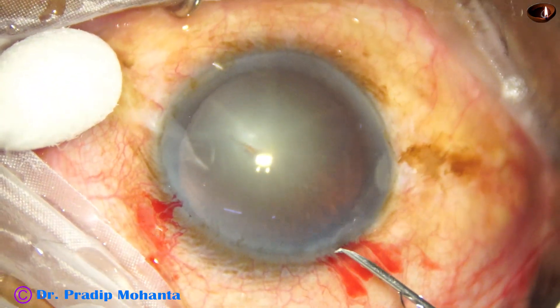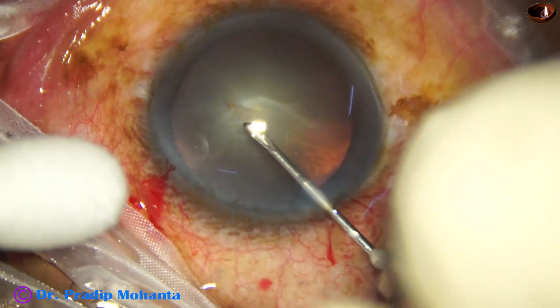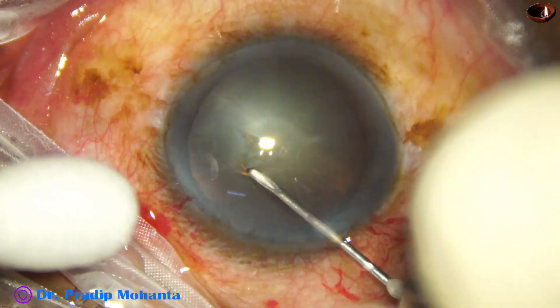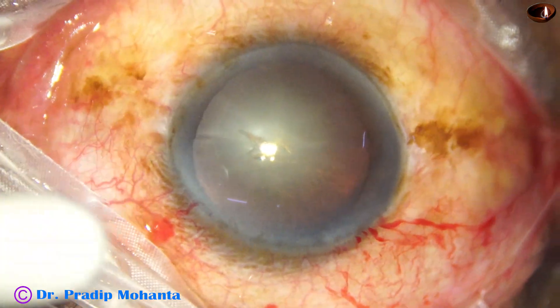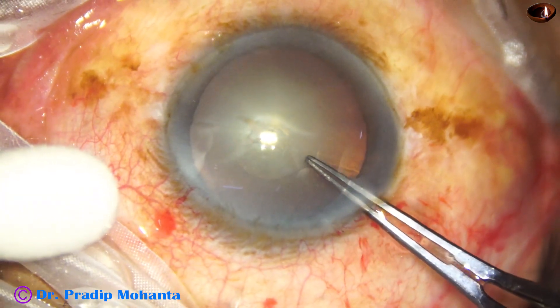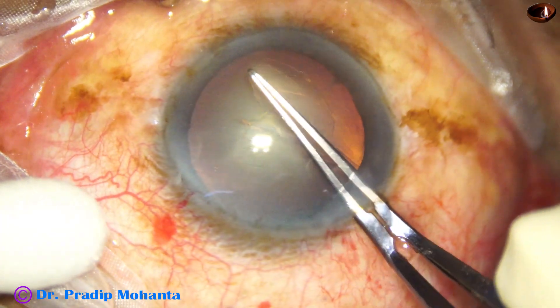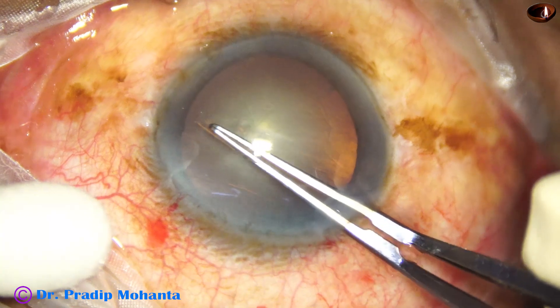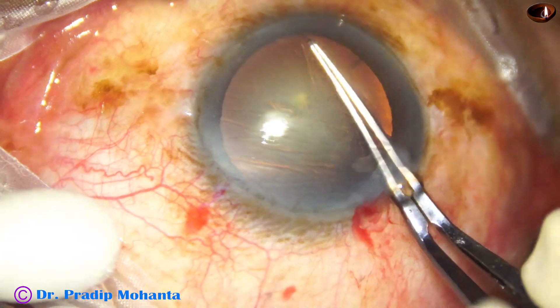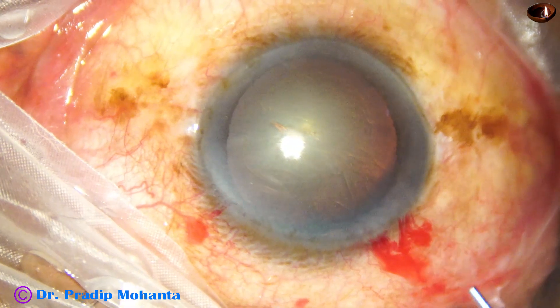I take a sharp bent needle and incise the anterior capsule to raise a capsule flap. When doing the rhexis, we have to remember to stay far away from the area of zonular dehiscence, that is from 10 o'clock to 1 o'clock. The rhexis will be far from the equator of the lens, meaning the rhexis will be eccentric.